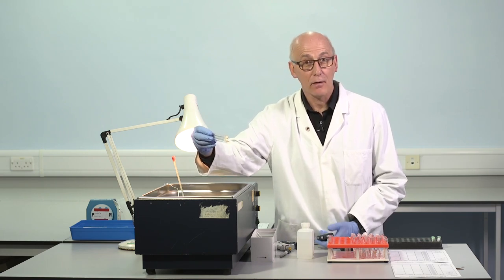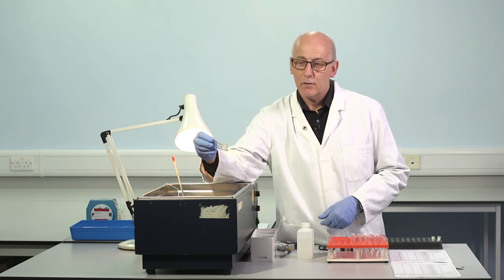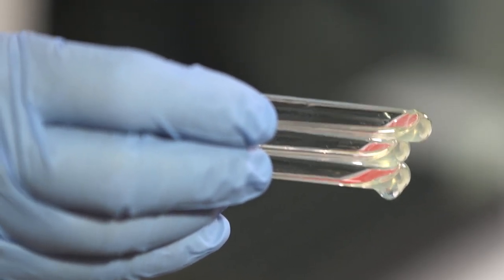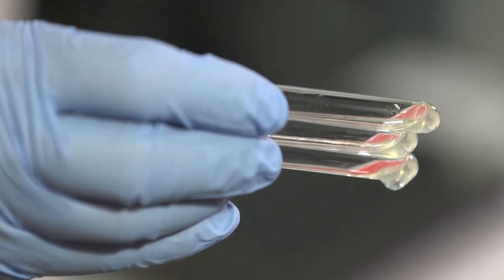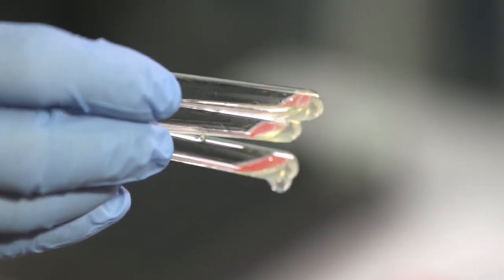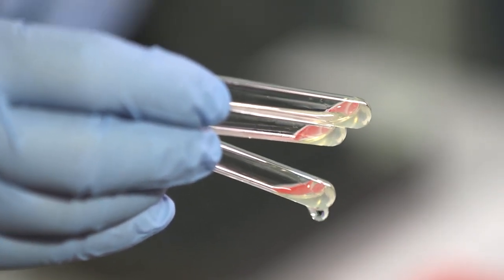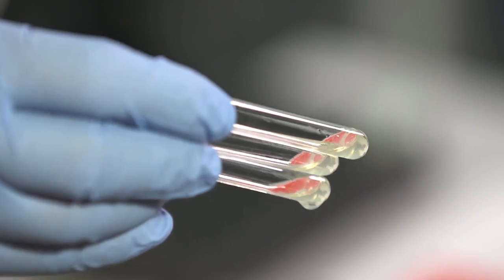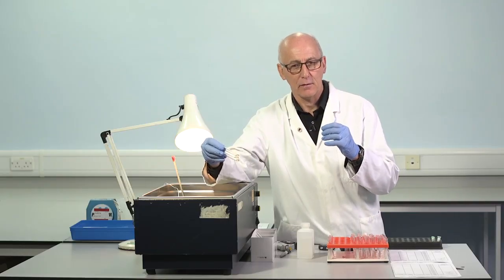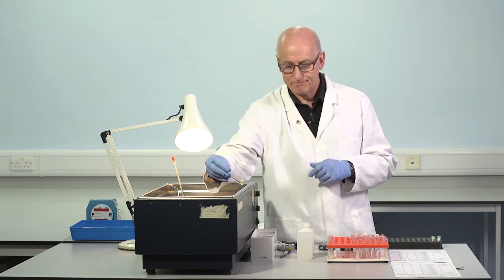So we've now got a clot in all 3 tubes. The nature of the clot is really quite obvious. It's a solid structure, at least it is for most of the clotting times. If we have a very prolonged clotting time at this stage, up to 120, 130, 140 seconds, then it can be a much weaker endpoint. But even then, I think it's clear that a clot has occurred.